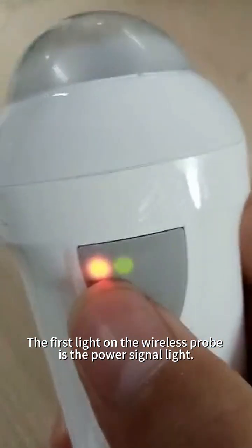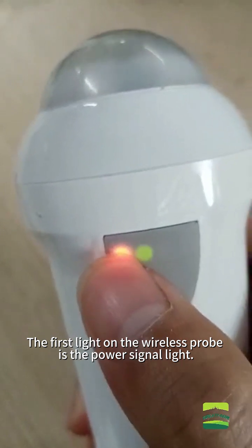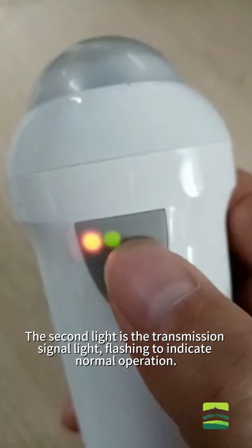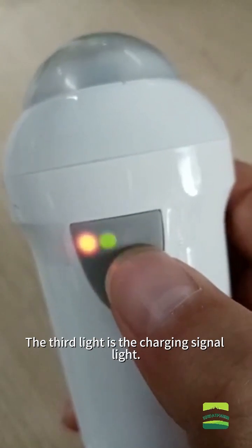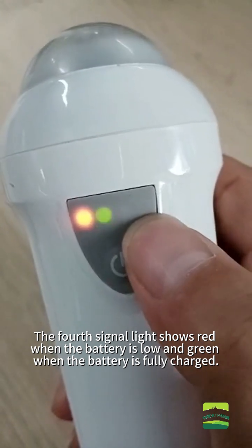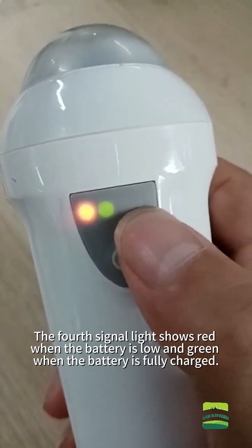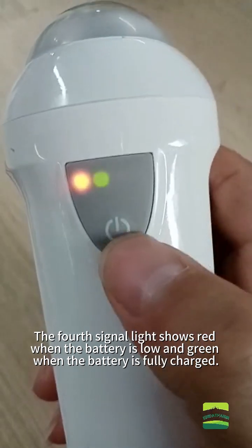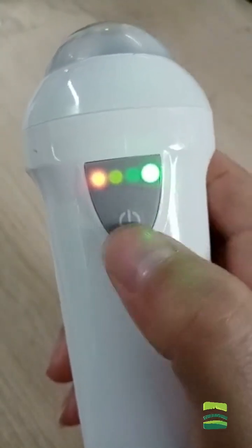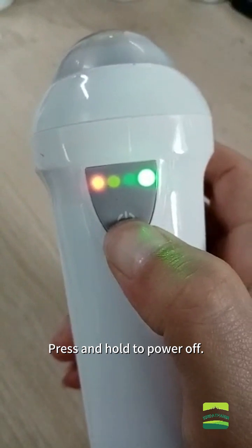Press the start button to start using the device and press it again to pause. The first light on the wireless probe is the power signal light. The second light is the transmission signal light, flashing to indicate normal operation. The third light is the charging signal light. The fourth signal light shows red when the battery is low and green when the battery is fully charged. Press and hold to power off.